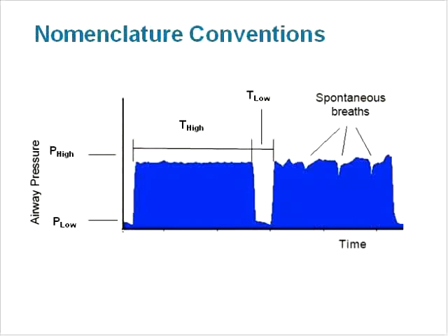Note that P high is measured relative to atmospheric pressure, as is common on infant ventilators and on some transport ventilators. This can cause confusion when switching a patient from a conventional pressure-controlled mode to APRV, because conventional pressure control modes for adults define inspiratory pressure relative to baseline pressure, or PEEP. The problem is that if you set P high and P low equal to PIP and PEEP on conventional pressure-controlled ventilation, you will end up with lower tidal volumes during APRV. If what I just explained is not obvious, you need to think about it until it is.